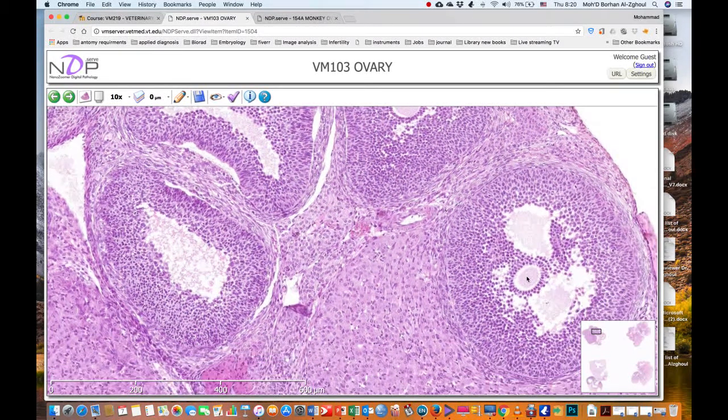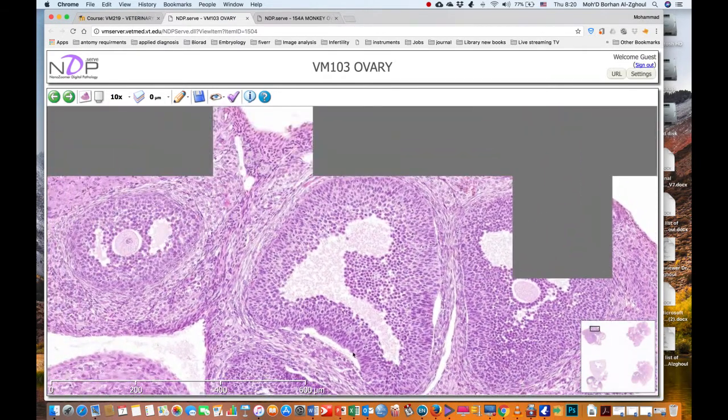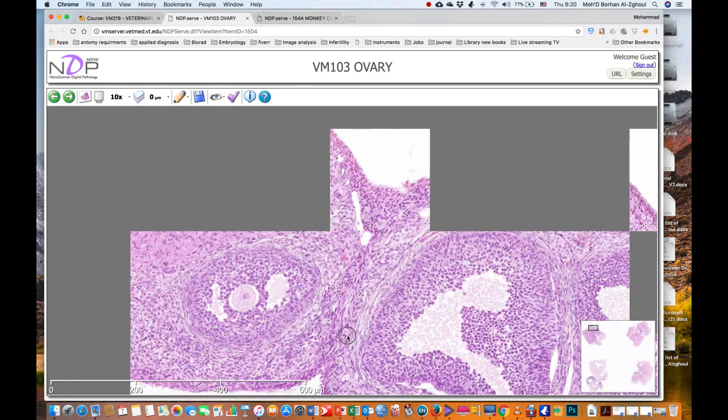In the mature follicle, the location of the oocyte will be eccentric in the periphery, and we will have a very big space containing the follicular fluid. So most of these, what we can see is the pre-antral.